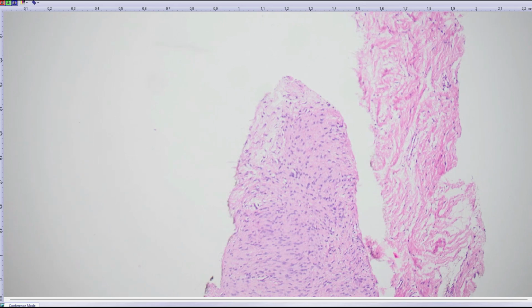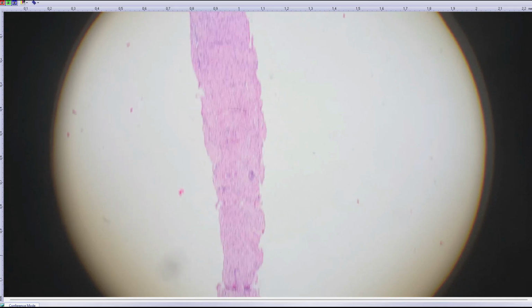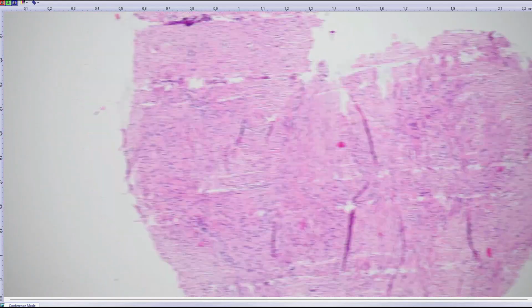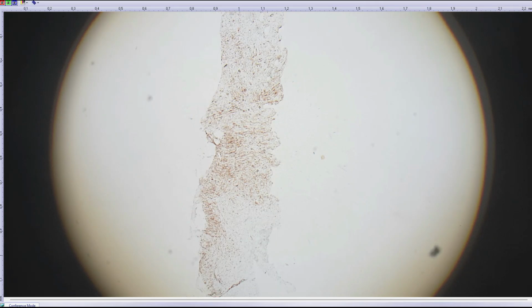So any differential in the psoas muscle, in a 44-year-old lady? We should definitely exclude dedifferentiated liposarcoma. The patient is quite young, but still, we should test for MDM2. That was negative. Then we should test for smooth muscle differentiation. Smooth muscle myosin, h-caldesmon, and desmin were negative. Those are the more specific. The least specific is smooth muscle actin, but it's, as usual, the most sensitive.